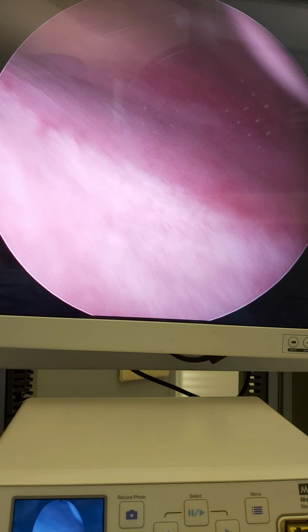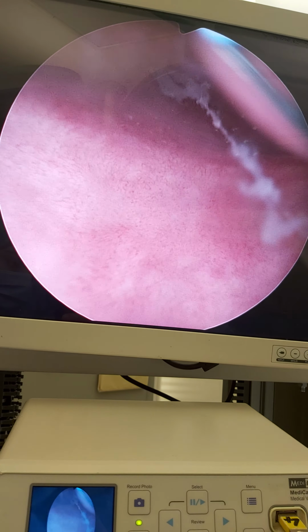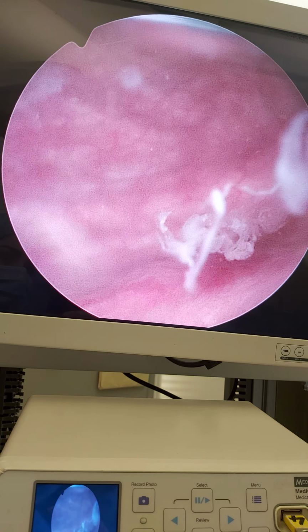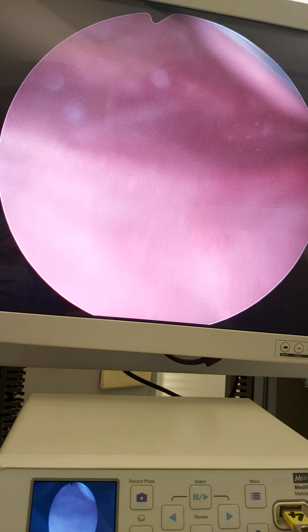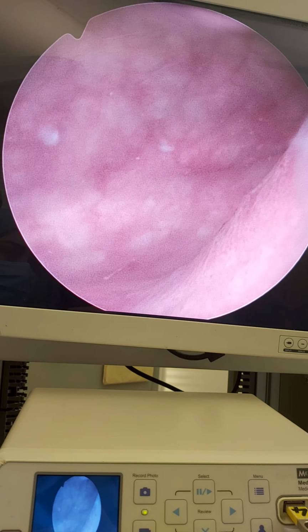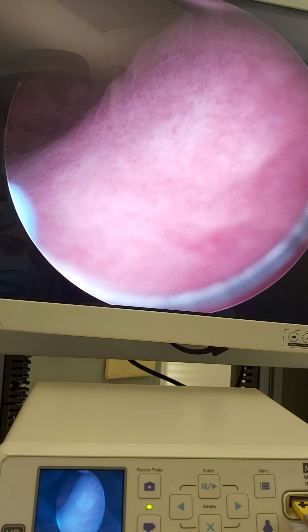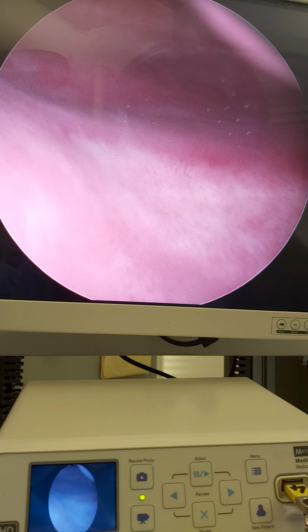Nowadays I improve the procedure a little bit. I sometimes fulgurate behind the Trigon, these areas, if they are patchy, red, inflamed. And now look at this part, a free floating infected particle here. In the Trigon, do we need another fulguration? Not easy to make a decision, but it seems a little more reddish and inflamed than normal.